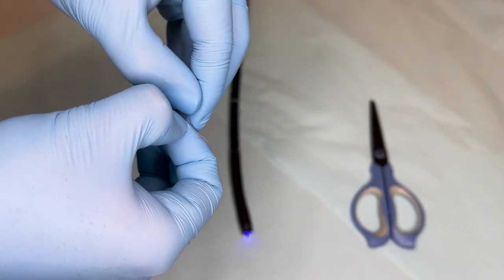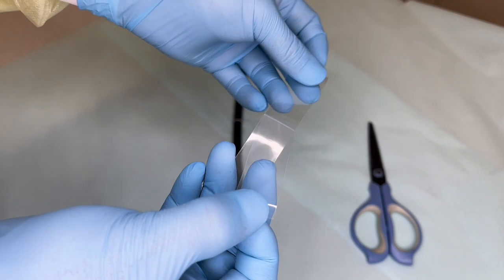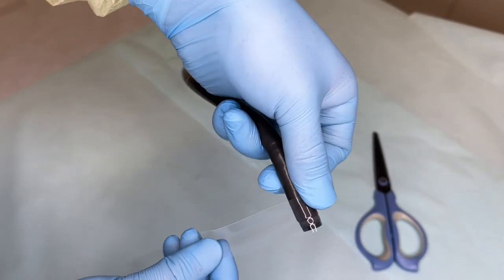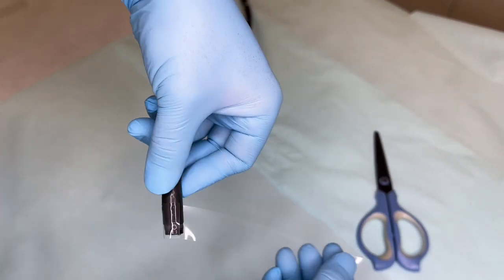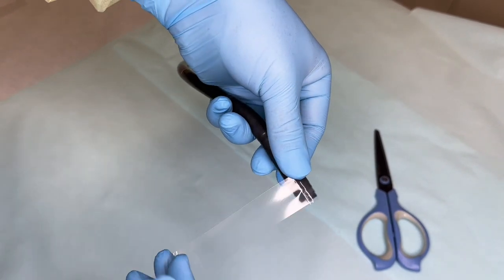First, both sides are peeled off. Then the tape is wrapped around the endoscope, adjusting the tape's length visible from the endoscope tip. Two or three rows of tape are sufficient in terms of firmness.